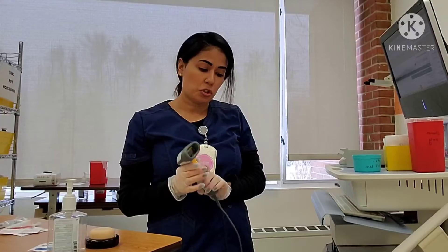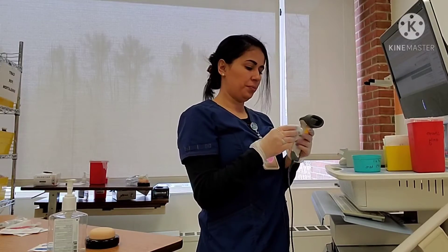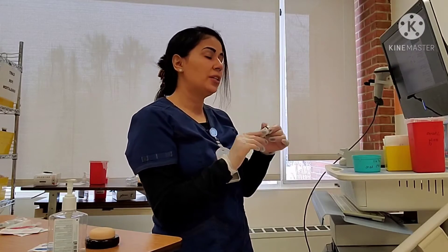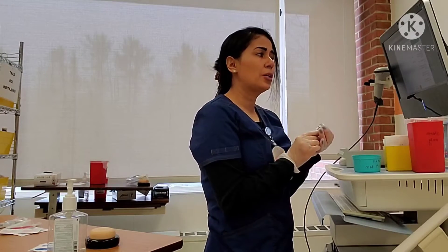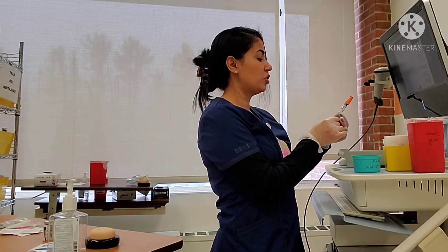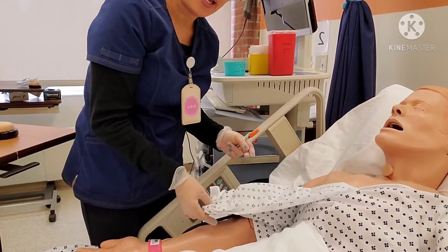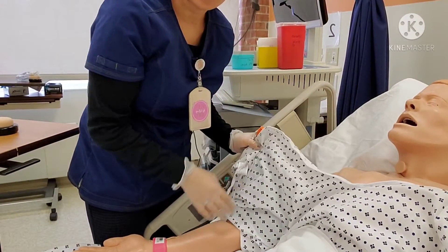My patient has requested the back of the arm, and that's totally fine. Now I'm going to scan my patient and scan my medication and do another check to make sure everything matches. I'm going to administer regular insulin; my blood glucose was 250, and based on the sliding scale I'm giving four units of regular insulin — and that's what I have here. I'm using my insulin syringe and I have four units of insulin. Everything looks good.